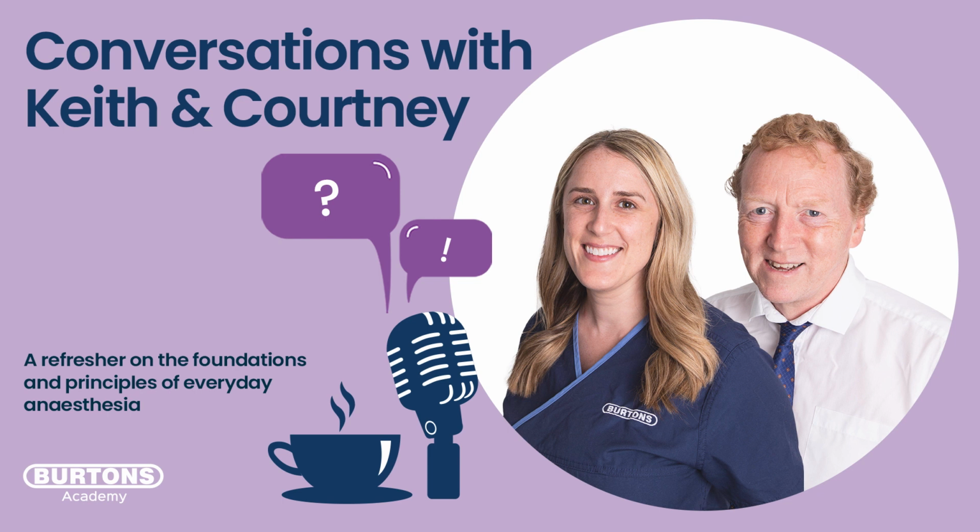Okay, so other things that will restrict the diaphragm are pregnancy, significant obesity. So if you have, say, a cesarean that comes in with a fully gravid uterus, you can imagine that that's going to push against the diaphragm. So you're going to have to expect a reduced compliance, and therefore by reduced compliance, it means that the pressure at the end of a volume-controlled inspiration is going to be higher. So the compliance has a big effect.